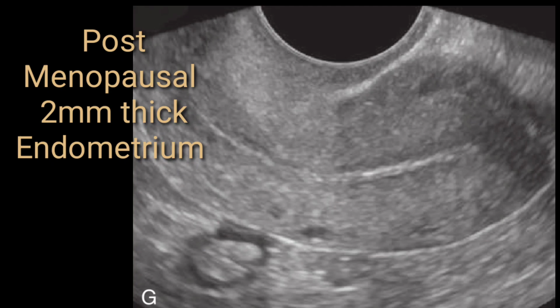Normal postmenopausal endometrium should not be more than 5 millimeters. It should be between 2 to 4 millimeters. So that's why in postmenopausal patients the assessment of the endometrium is very important. And if they give you a history of bleeding, especially at that very moment, it is important to evaluate endometrial thickness. In this case, in this endometrial cavity, you can see there is 2 mm thick endometrium of the postmenopausal patient, which is quite normal. So this was a normal postmenopausal endometrial thickness.